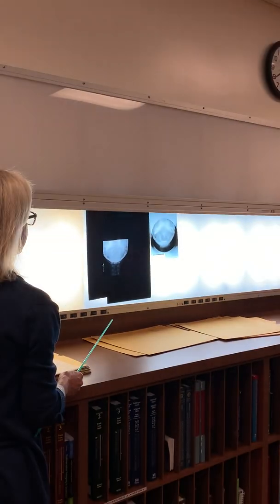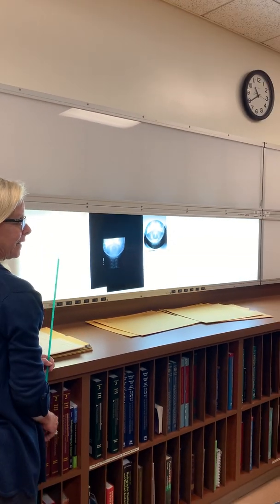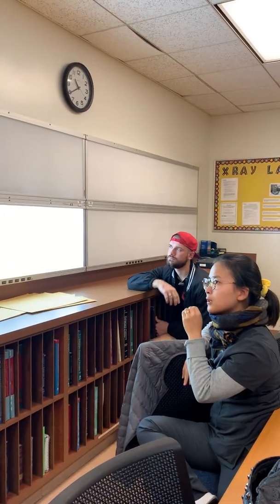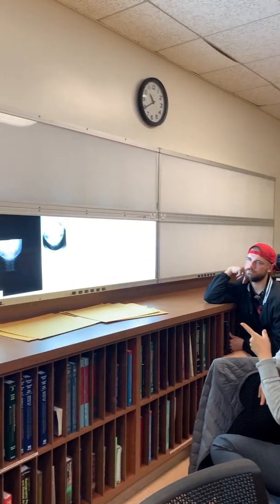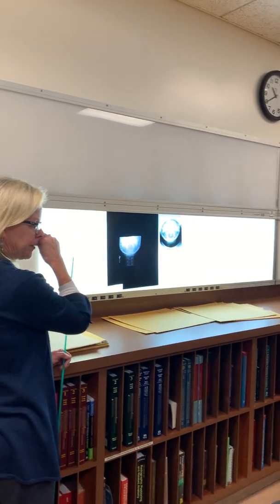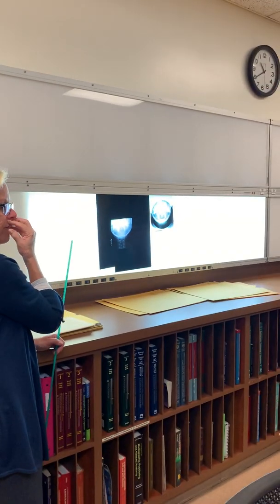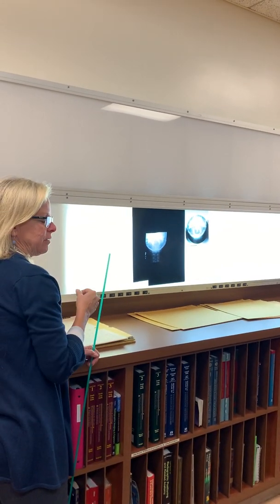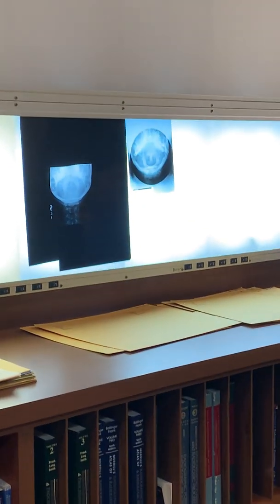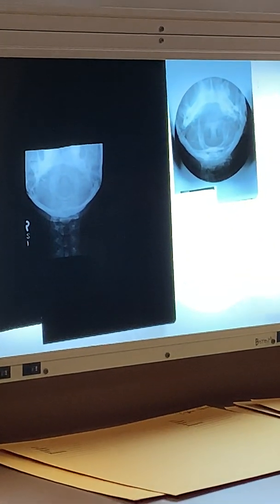Question. An X-ray tech said that the hard palate was getting in the way of the odontoid, and then he had to do a few. Was he saying the teeth? Did the person not have any teeth? No, he did. That's what he meant. Oh, the teeth, okay. Yeah, the hard palate, the palate of your mouth.